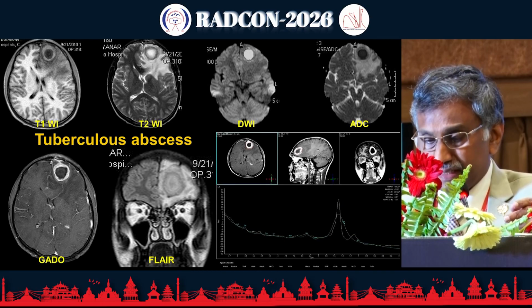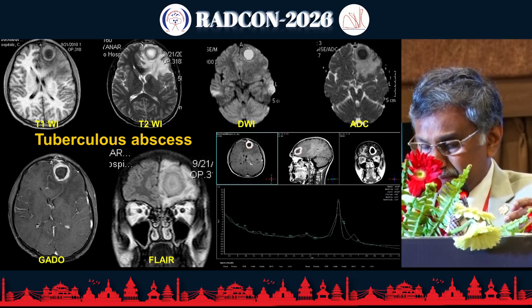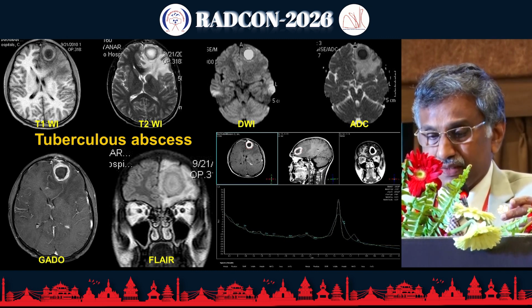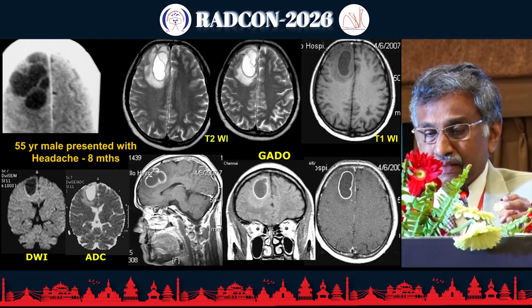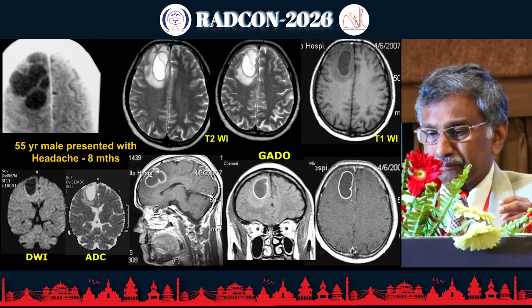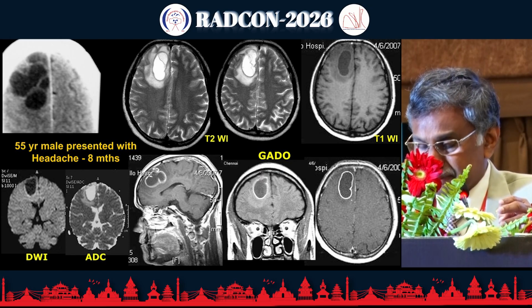On the other hand, you can get a lesion with a thick wall, enhancing, with very bright and dark signal intensity areas. Okay, this can be a tuberculous abscess. Only a lipid peak is there. So amino acids, lactate, and succinate favor pyogenic abscess, whereas tuberculous abscess shows only lipid. Here are lobulated cystic lesions and a cystic lesion with a thick wall, with homogeneous enhancement or peripheral rim enhancement.